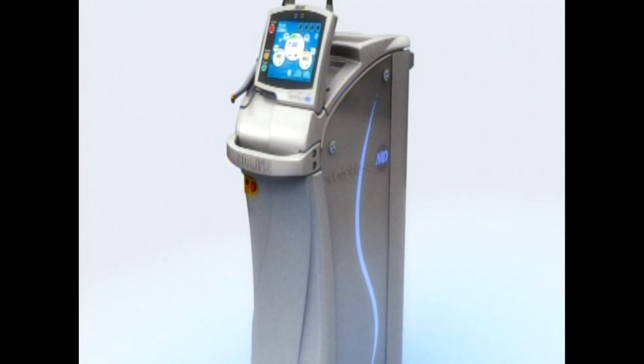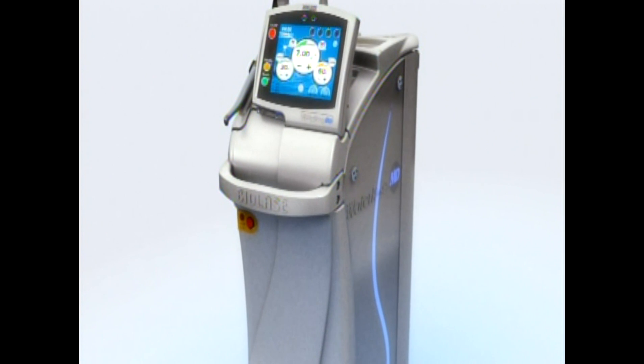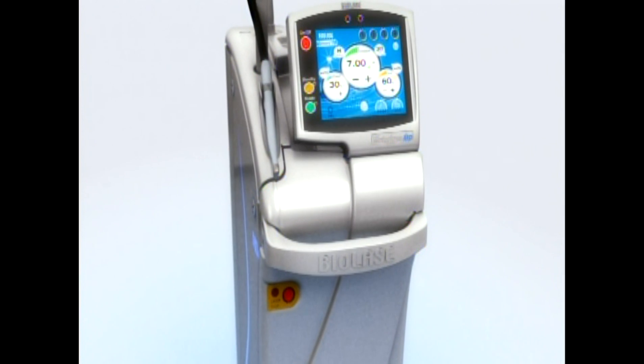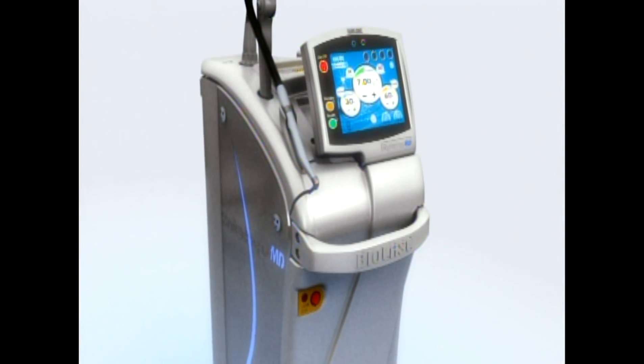The Waterlase MD is capable of cutting any class cavity preparation — 1, 2, 3, 4, or 5 — without any limitations.